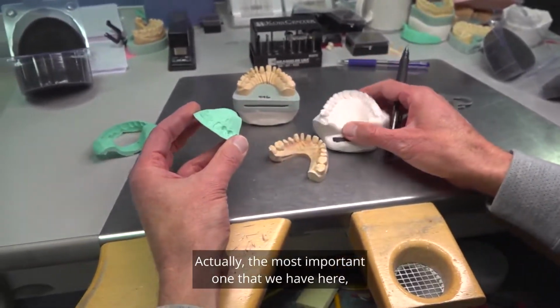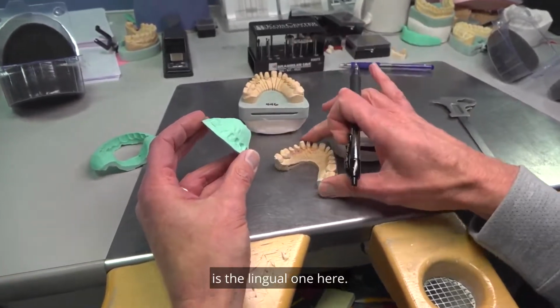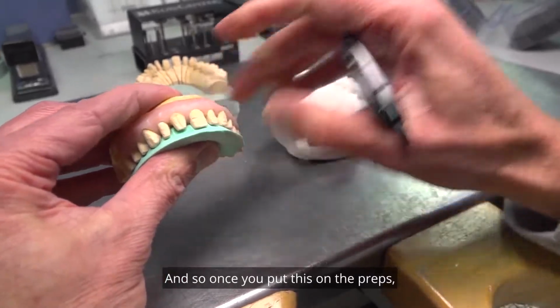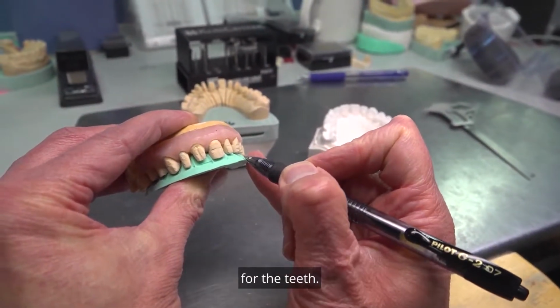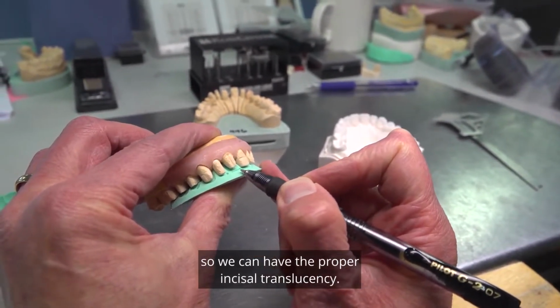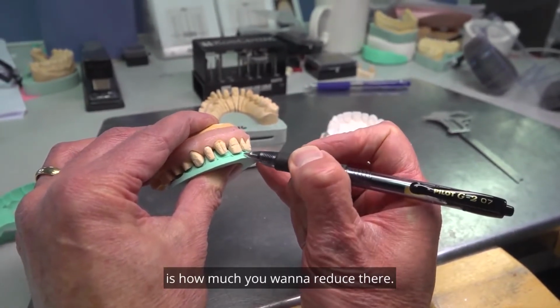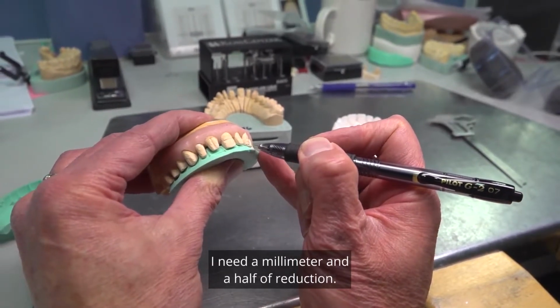Actually, the most important one, they're both very important, is the lingual one, because we're looking at this for the incisal reduction. Once you put this on the preps, you want to make sure that you have the proper reduction for the teeth, and obviously that was going to be a full crown, so we can have the proper incisal translucency. Depending on how much incisal translucency you want is how much you want to reduce there. If you want 1 millimeter of incisal translucency, I need 1.5 millimeters of reduction.